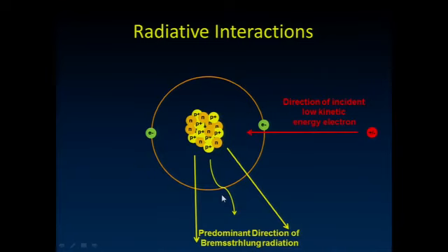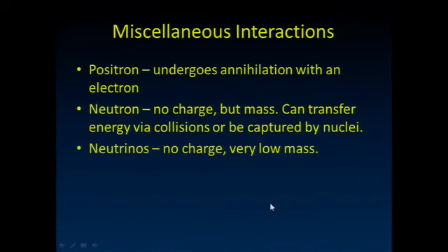And if you'll notice, that's where we put the X-ray window on our tube, right? Why does our tube have the X-ray window in the location it does? It does here because that's where the greatest number of those X-rays are produced.